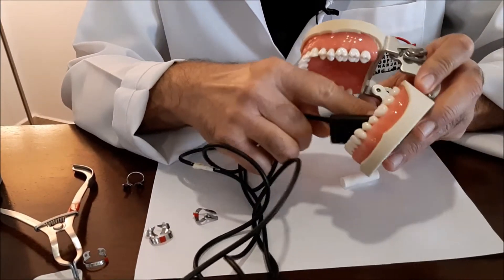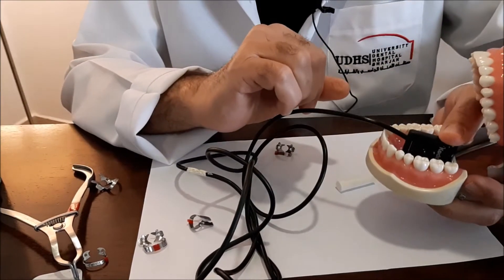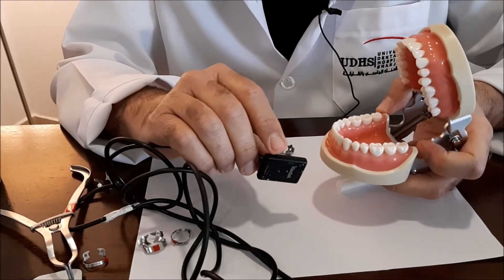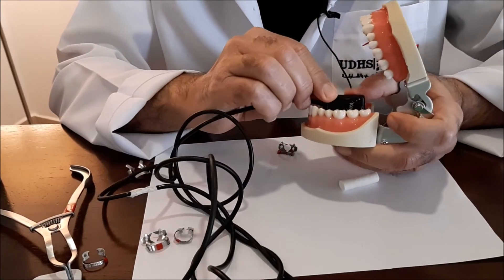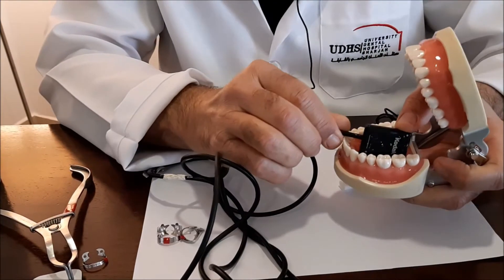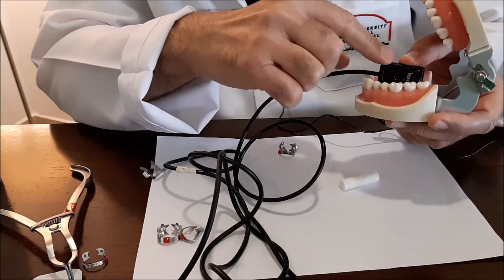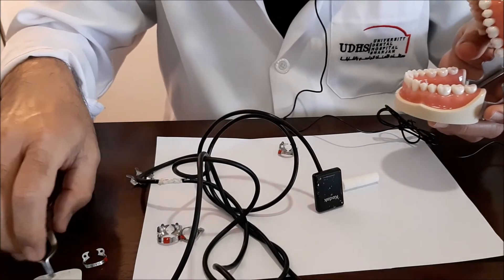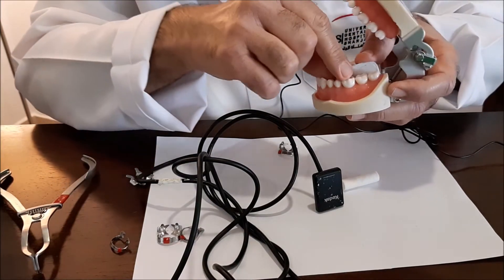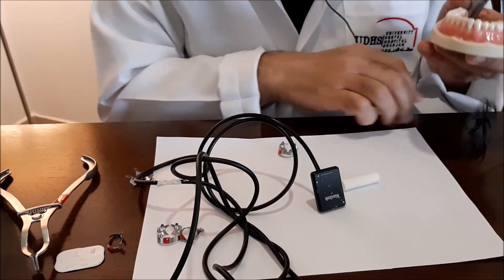This will help in pushing the film or the sensor all the way down to capture the apex. Now, because there is no flexibility in this area with this particular mannequin, we will assume that the sensor is going all the way down to the apex. Because this is hard plastic I cannot push the sensor all the way down, but we will assume the ideal relationship: only two millimeters extending from the superior border of the sensor to the occlusal surface.